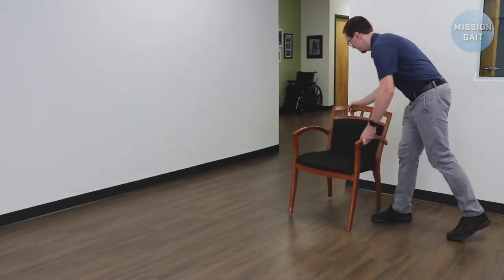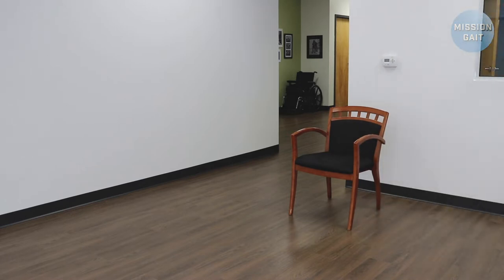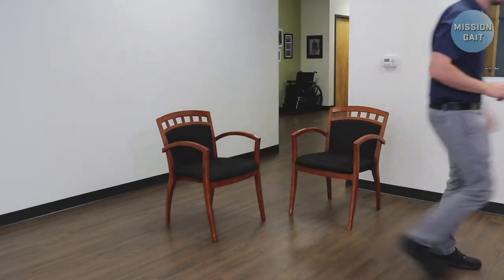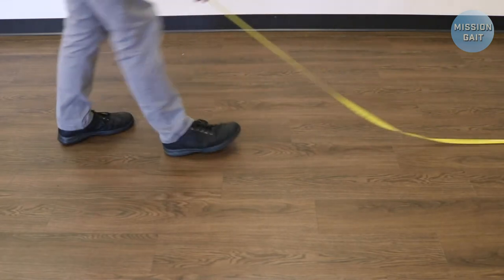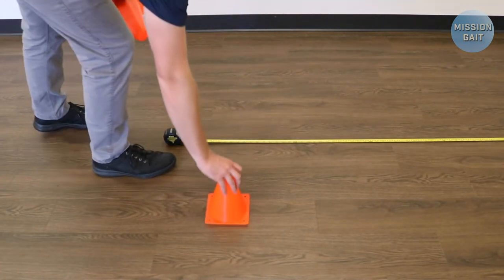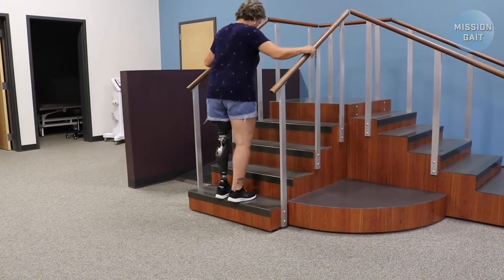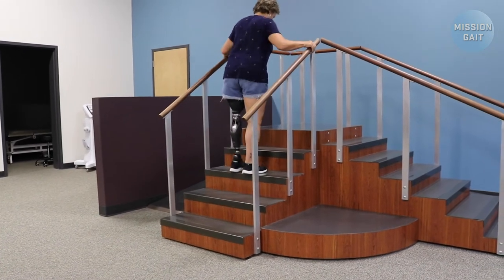Prior to starting this measure, make sure that you have all necessary materials prepared. First, place two hard chairs with armrests at 90 degrees to each other as shown. Next, measure a walkway of 12 feet or about 4 meters from one of the chairs, and mark the endpoint of the runway with either tape or cones. For one test item, you will need at least two stairs with a rail on both sides.